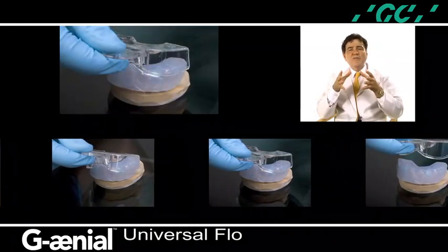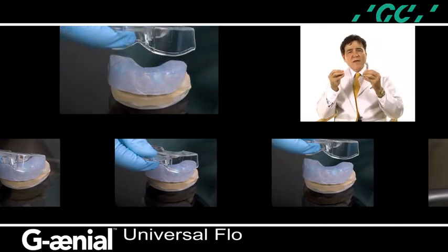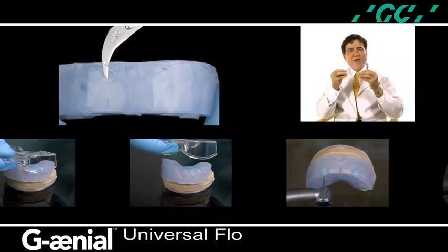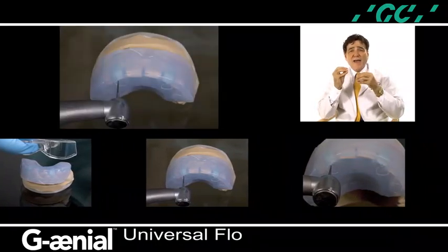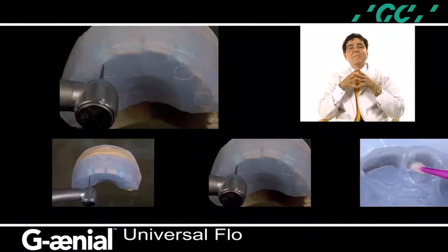The silicone matrix is easily removed from the non-perforated tray. If there is any excess material beyond the periphery of the tray, trim the material with a scalpel blade and re-inspect on the model. Next, I create small openings on the incisal facial edge of the lateral incisors with an 8-fluted needle-shaped finishing burr, an ET9 by Brasseler.